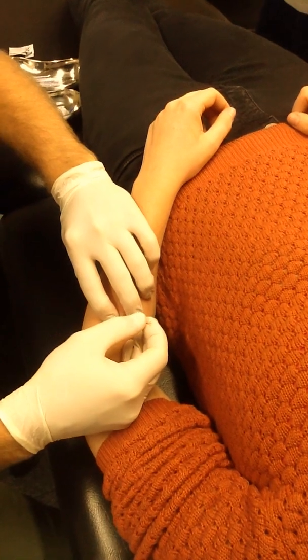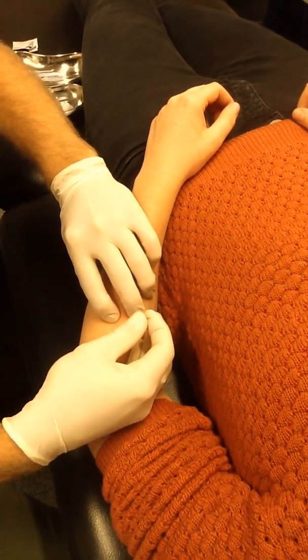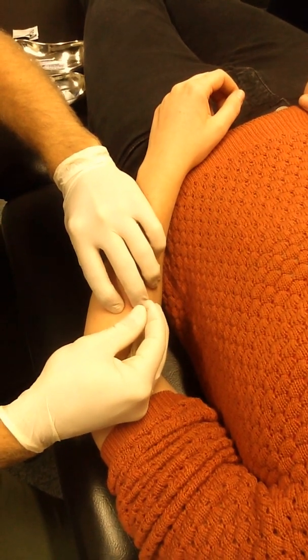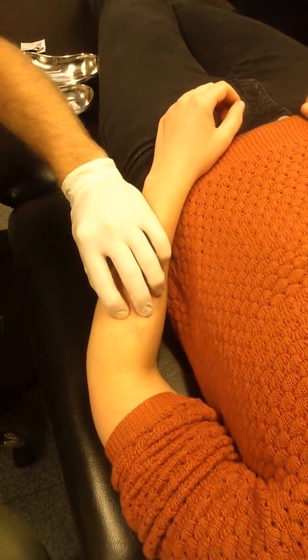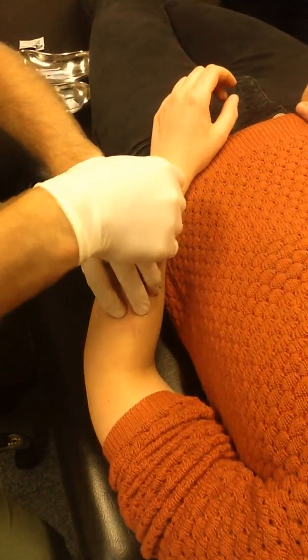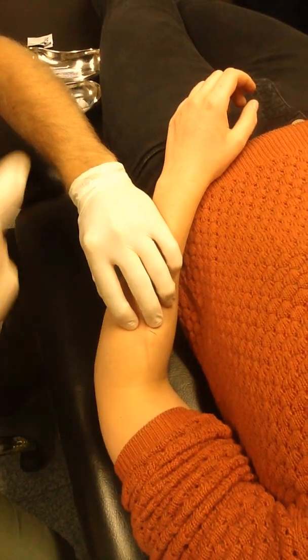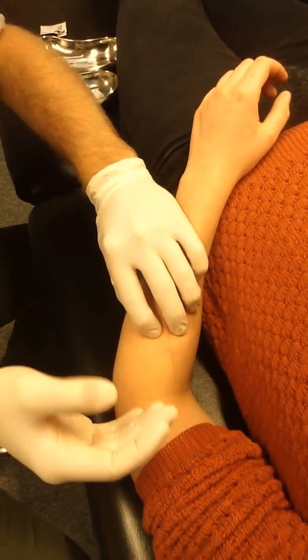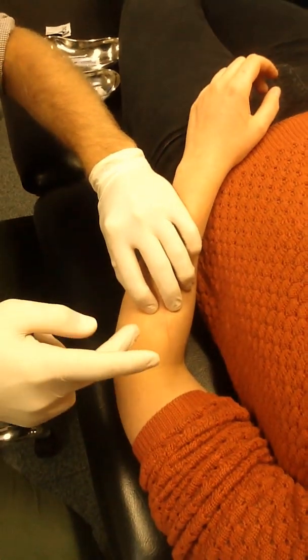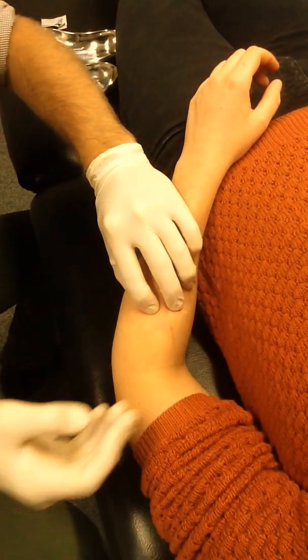So it was harder to feel prior to treating longus. So that twitch then — you saw the radius move, I felt the tendon move under my hand, we got that response. And so with the jumpiness that was happening when we were flicking over the muscle there, it kind of gives you that indication that maybe that was the one that was more appropriate to treat, rather than longus.